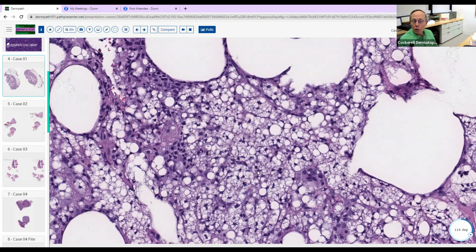So what else gives you clear staining besides lipid? I think the granular cell tumors can look kind of clear, but they look more granular. Yeah, I agree. I don't think they're really in the classic differential diagnosis of clear cell things in the skin.